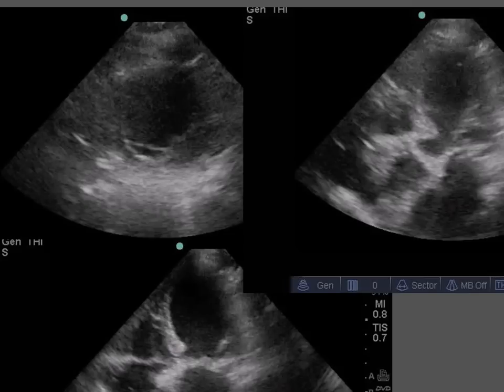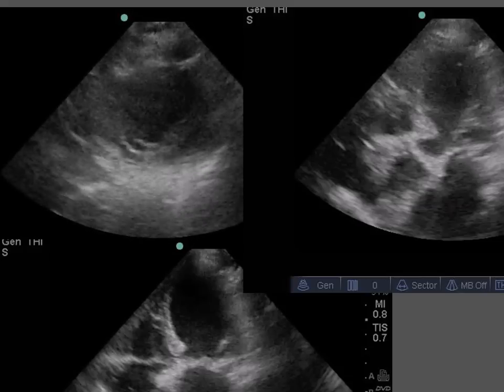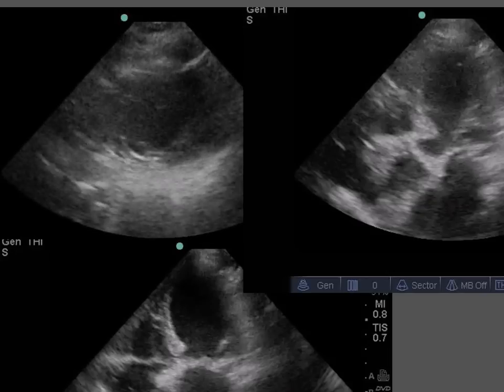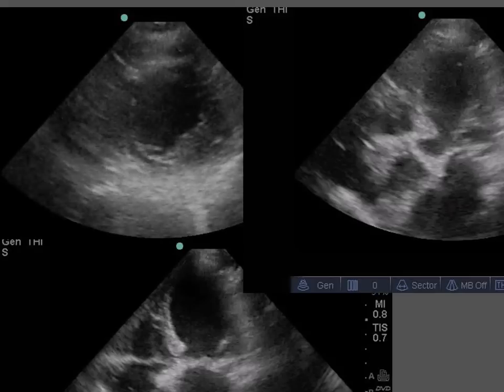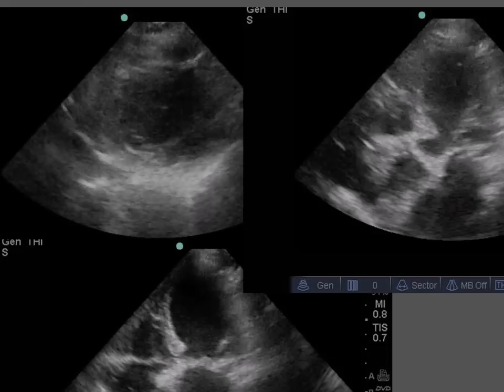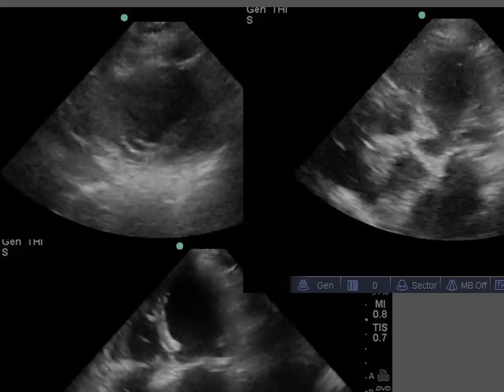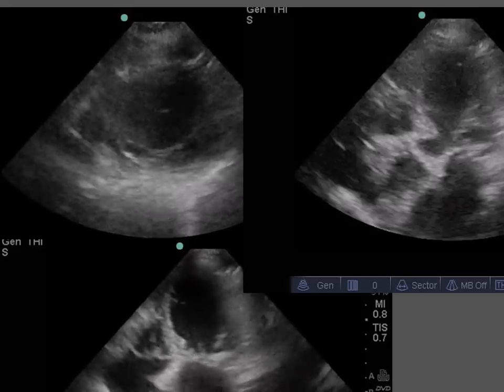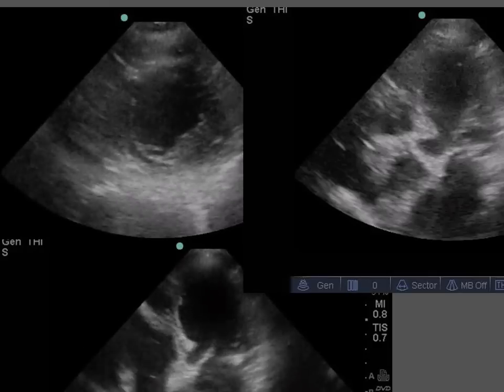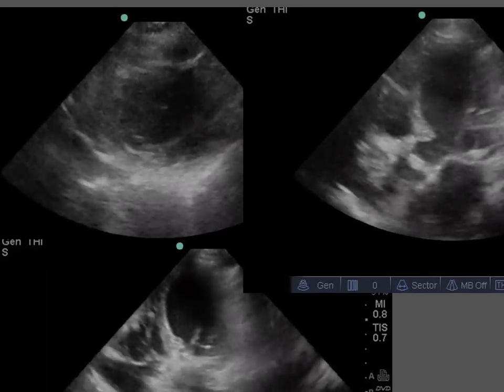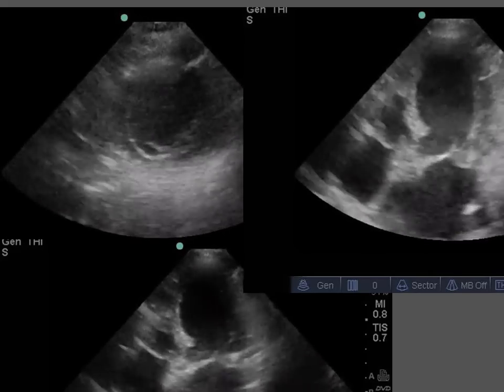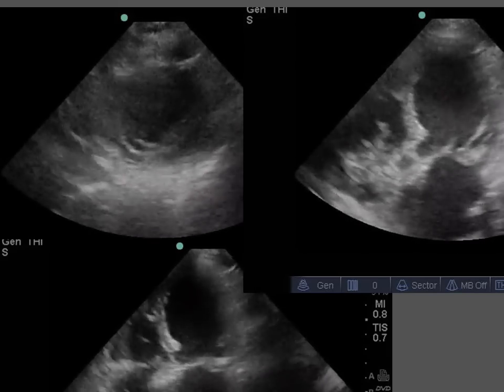Now we're going to go through a bunch of cases, and this next set is all from the same patient — which is what you'll want to do with patients you're worried about, making sure you're catching views in multiple planes. This first view is parasternal short, and it's a little bit difficult to tell exactly what's going on — maybe the RCA, maybe the LAD. But looking at the next view, the apical four chamber, you can see that septum really isn't moving very much. On that view you can't catch the lateral wall well, but on the final view the lateral wall is visible and it looks like it's moving. So this looks most consistent with an RCA lesion.